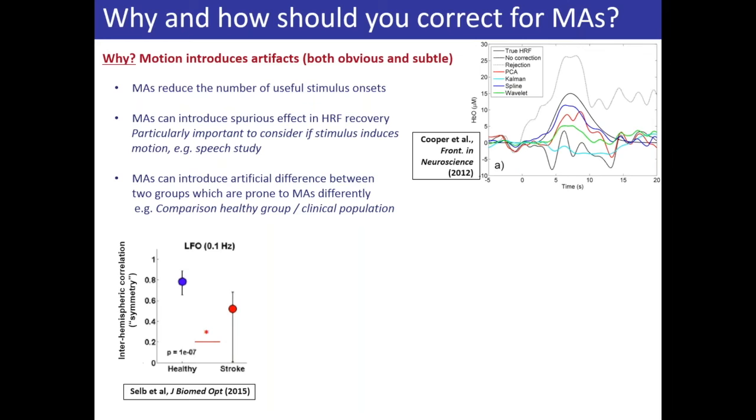So she looked at interhemispheric correlation in a healthy group as well as a stroke patient group, in low frequency bands, and she found a huge statistically significant difference between the two groups. But then she also looked at the motion artifact segments in those two groups. This is just the number of motion artifact segments in healthy and stroke population, and she saw that there is a significant difference. So actually what we were seeing as an interhemispheric correlation, and we could easily go ahead and derive many neuroscientific conclusions from that, was just because of the different motion artifact content in the signal.